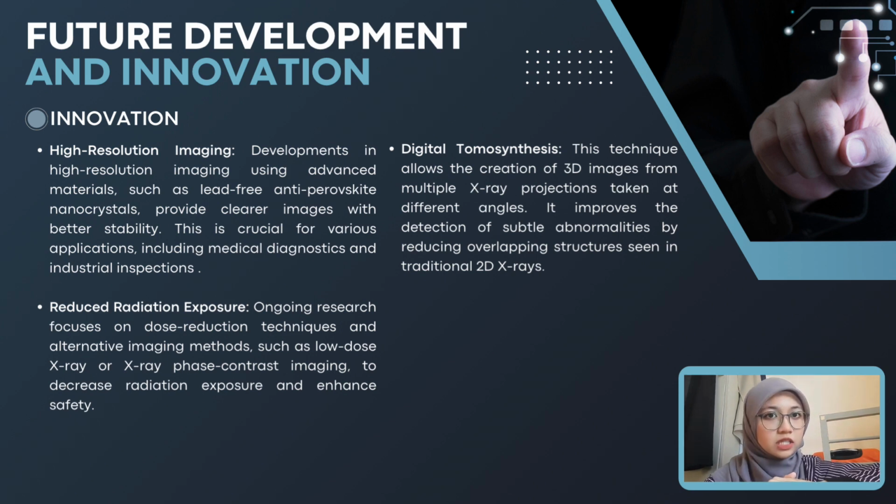And last but not least, for the future innovation in X-ray, there is digital tomosynthesis. This technique allows the creation of 3D images from multiple X-ray projections taken at different angles. It improves the detection of structural abnormalities by reducing overlapping structures seen in traditional 2D X-ray. So that's all for the future development and innovation. We will move on to the next part.